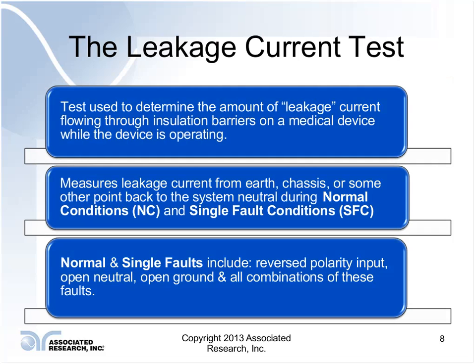What it is, it's basically a test used to determine the amount of leakage current flowing through insulation barriers on a medical device while the device is running. And that's a key point here. You want your device to be up and running. You want it to be in a state as if somebody was going to be using it. So like a doctor's going to be using this thing, or it's attached to a patient. You want the thing to be fully booted up and running.